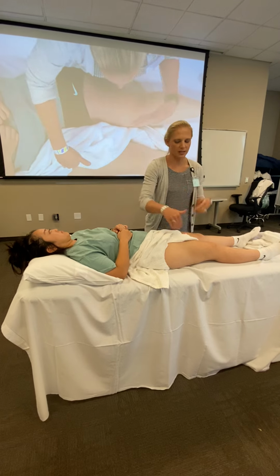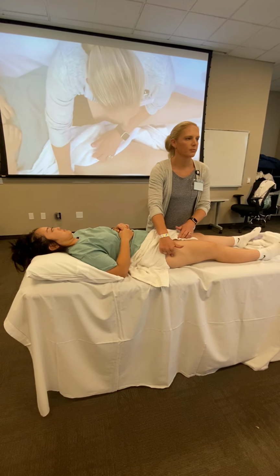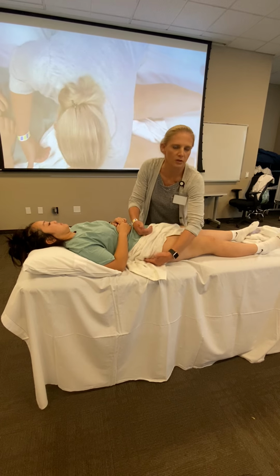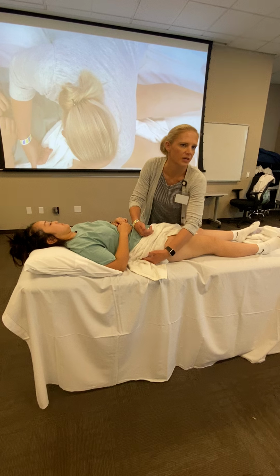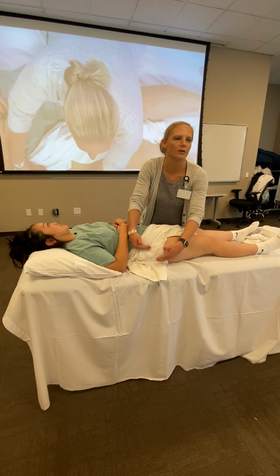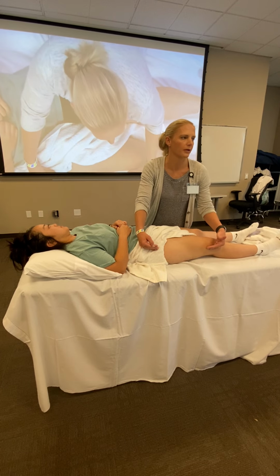I just want you guys to see setup. You're gonna drape to expose greater trochanter. That's gonna be your fulcrum. Stationary arm is gonna be midline of the pelvis, so kind of in between ASIS and PSIS. Moving arm is down along the femur, pointed towards that lateral femoral condyle.